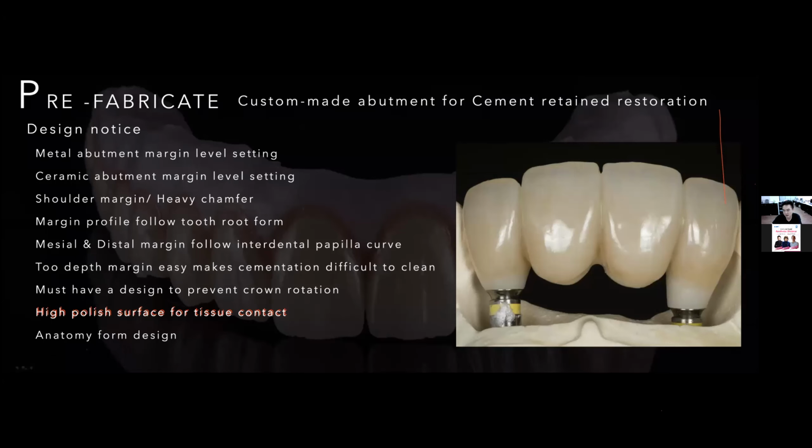Another important thing is please don't apply glaze or stain on this area, because under the tissue we want the zirconia or titanium surface to be friendly with the tissue, but stain or glaze is not good for our tissue.